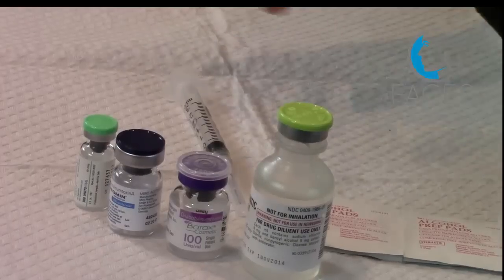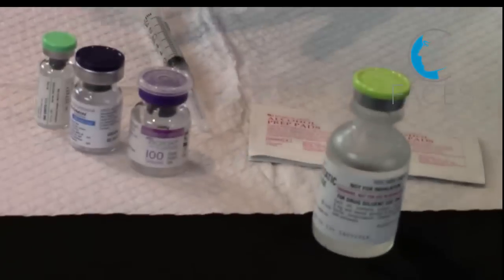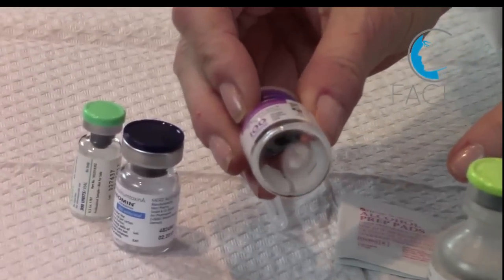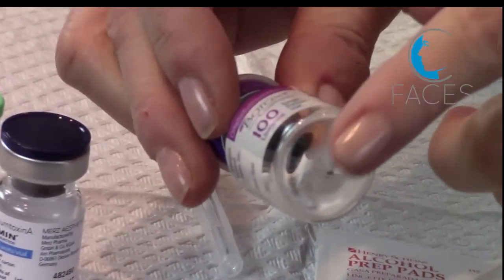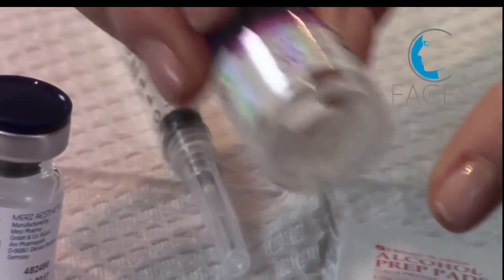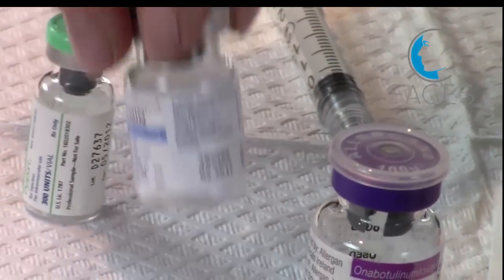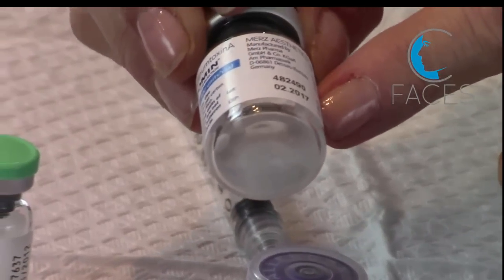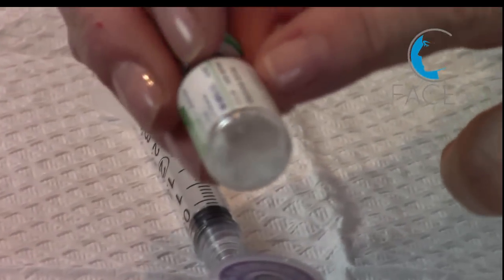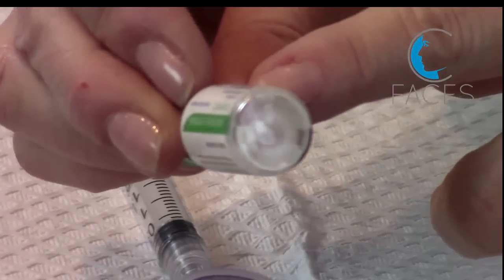When you open the box of neurotoxins, depending on the formulation, the presentation will look slightly different. Here you have Botox, which has a very faint snowflake-like appearance at the bottom — there's virtually no powder in there. Xeomin, on the other hand, has a fair degree of powder inside. Dysport is a powdery presentation as well.